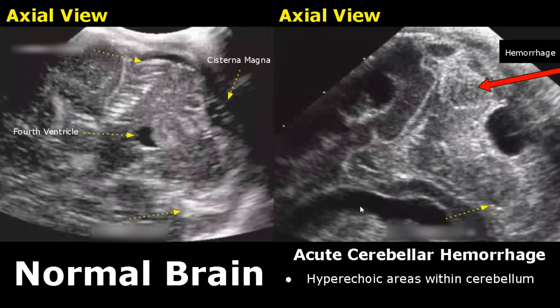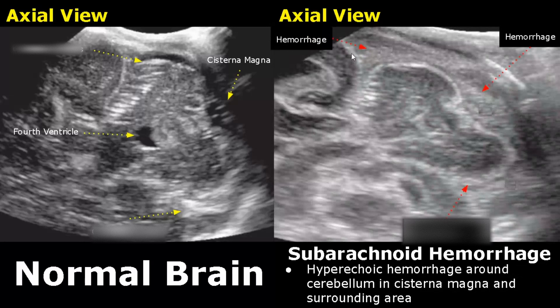This is a case of acute cerebellar hemorrhage — hyperechoic bright areas are seen within the cerebellum. Subarachnoid hemorrhage can also be visualized on ultrasound; in some cases we will find hyperechoic hemorrhage around the cerebellum in the cisterna magna.